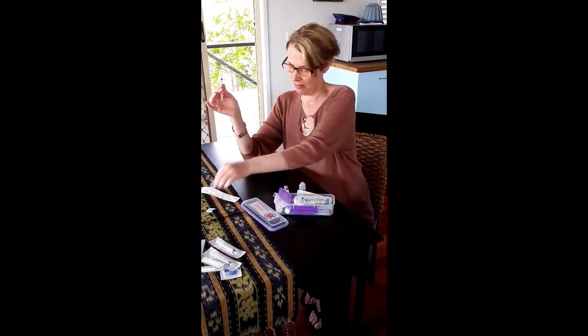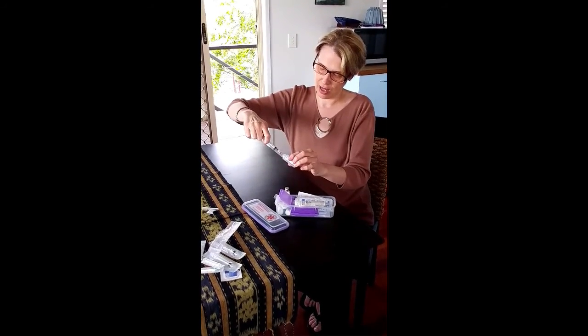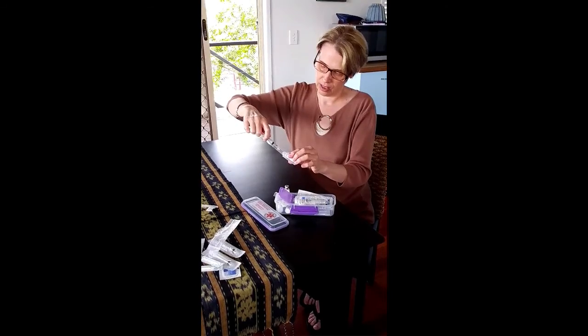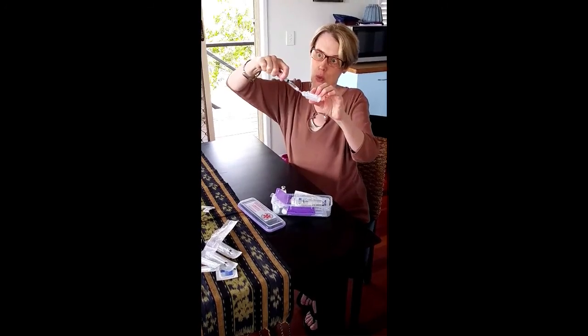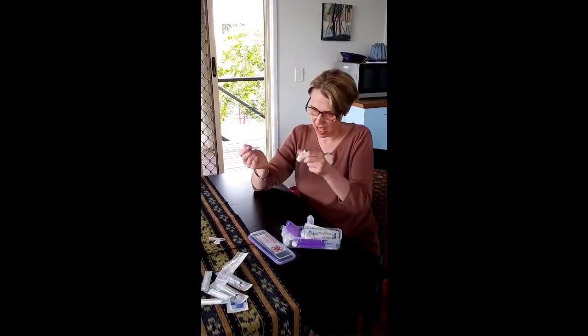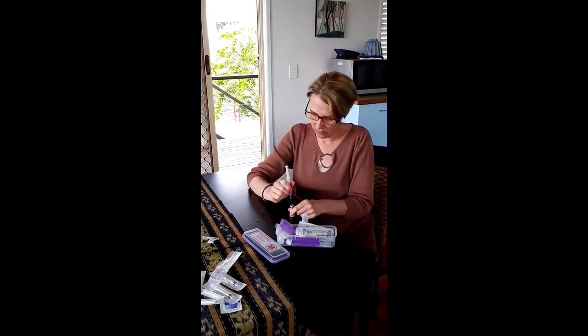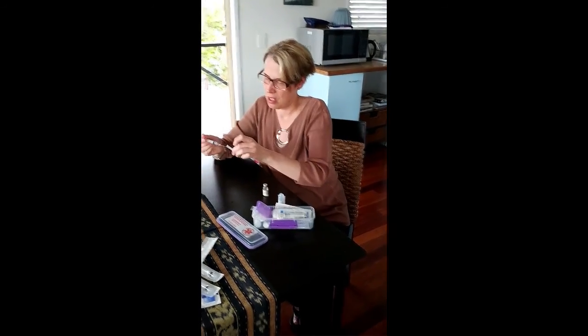Do a slight twist and pull to remove the needle cap, then pull back until you have two mils. Sometimes you might get a little bit of air and need to go at a slight angle. Once you have the two mils of water in the syringe, put that into the center of the solu-cortef, then remove the syringe and wait for it to dissolve.